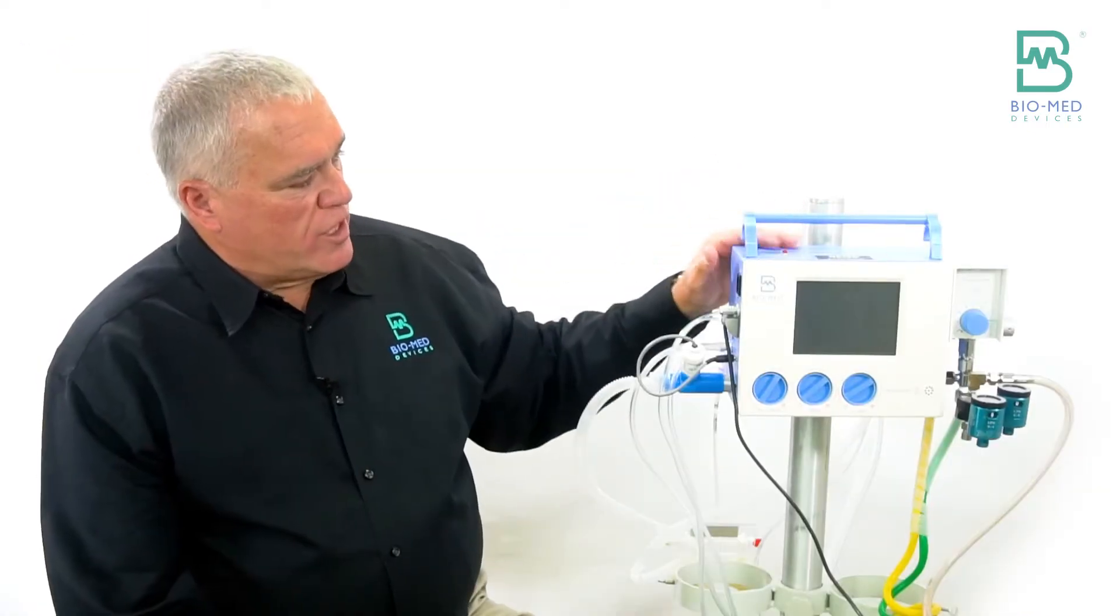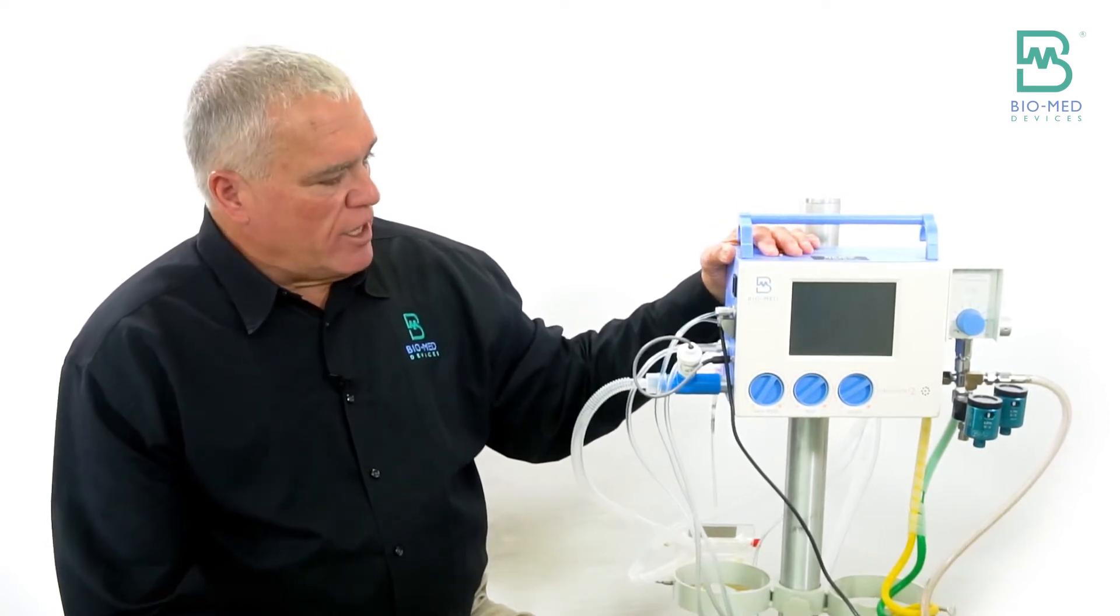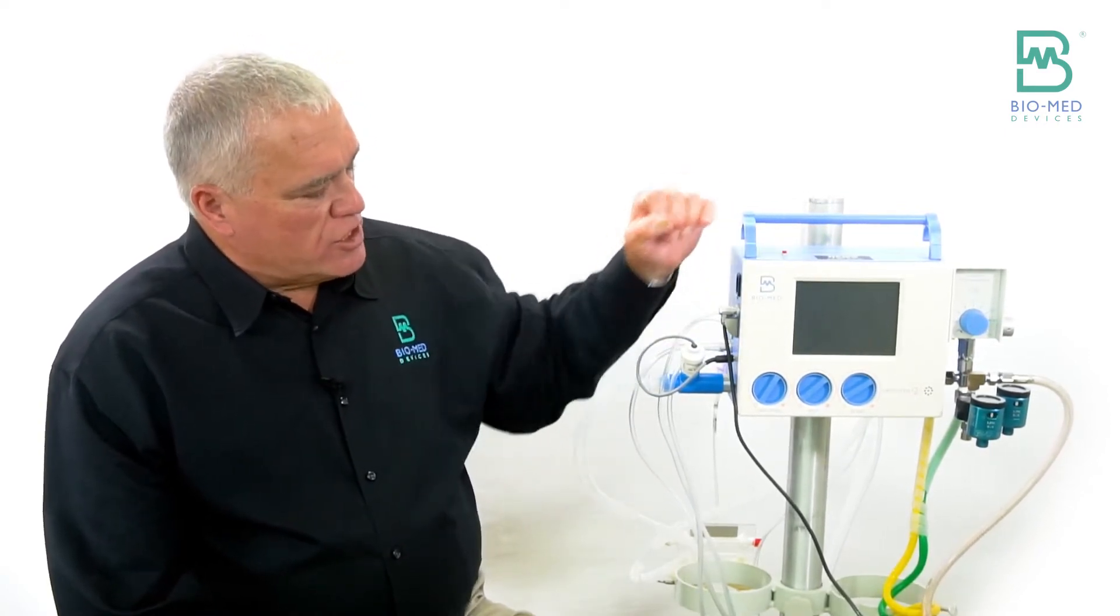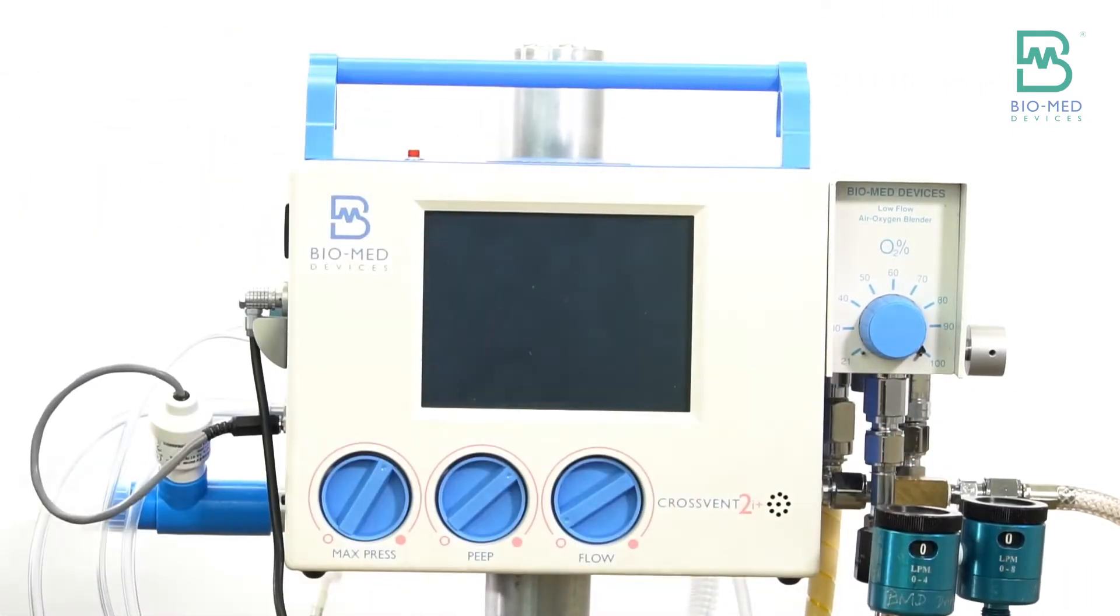People will use this in conjunction with the Bunnell high-frequency jet ventilator. As such, it can be mounted on the same pole. It's got a built-on blender. We added the flow meters, coiled hoses.